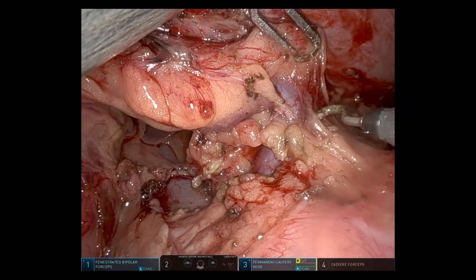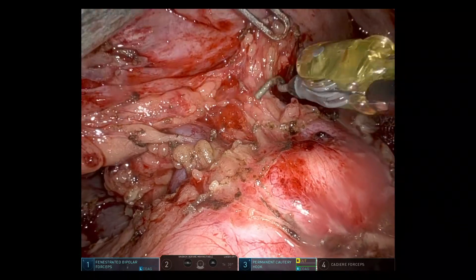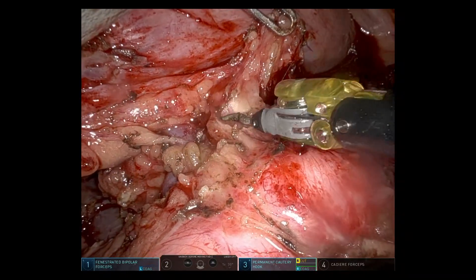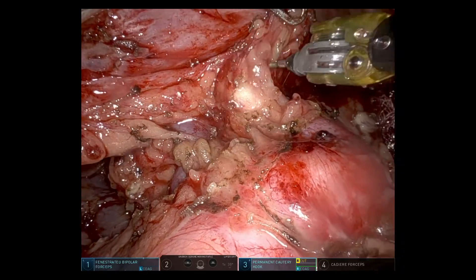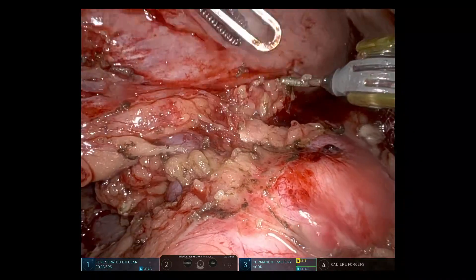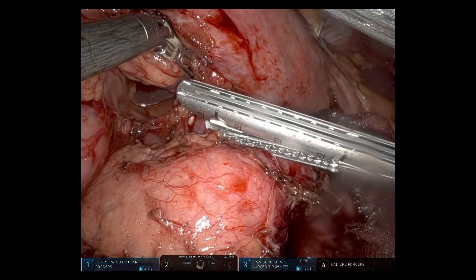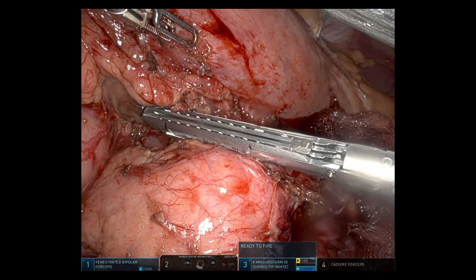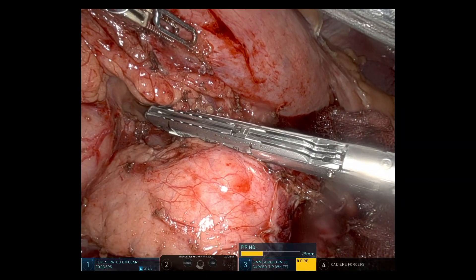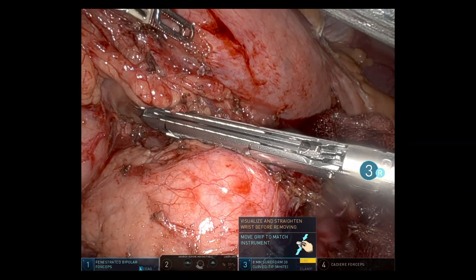Dealing with this dilated coronary vein now, dissecting it out — it was right next to the splenic artery, which comes into view. This patient had aberrant arterial anatomy with a common hepatic artery coming off the SMA, so the splenic artery was the only continuation of the celiac axis. Using the 30mm stapler to divide the coronary vein.